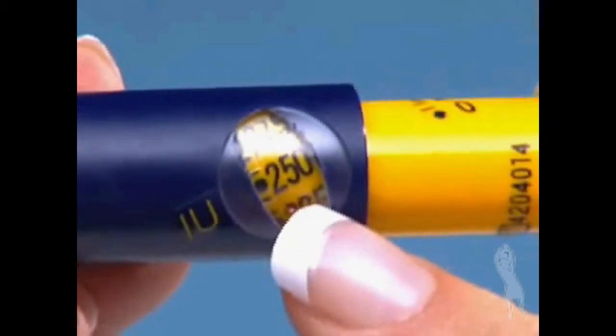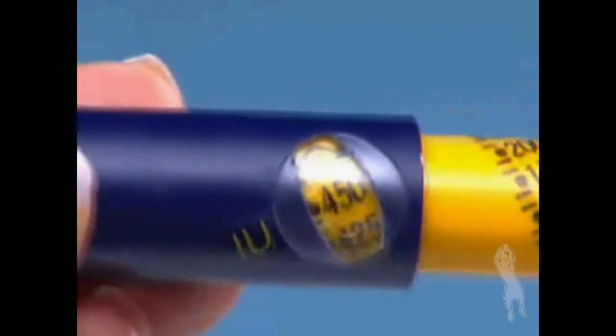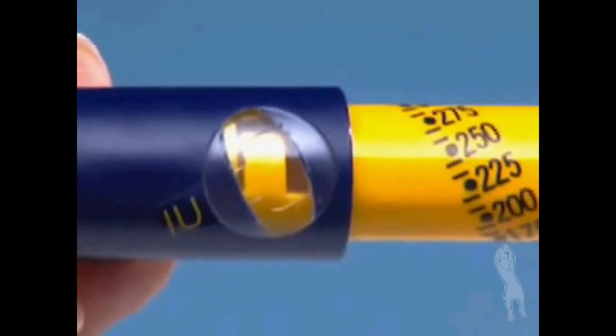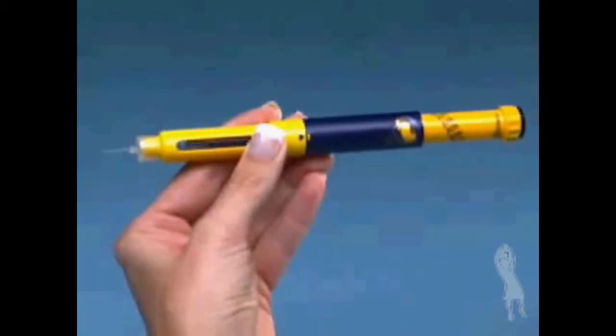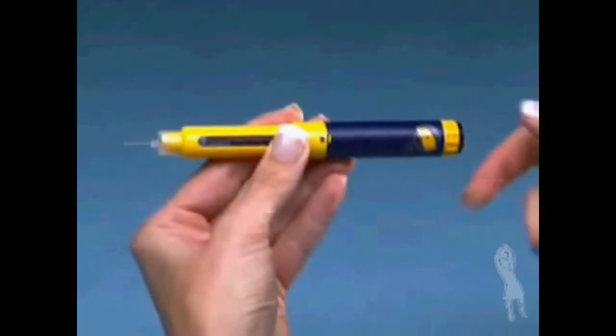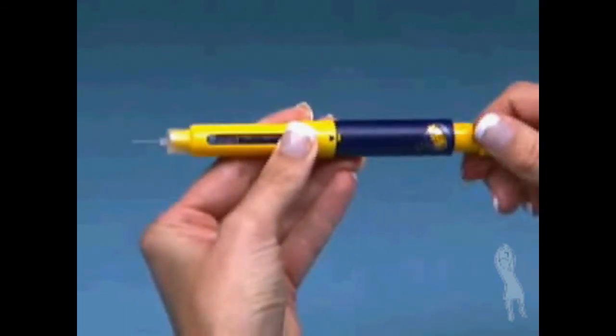If by mistake you dial past the correct number, do not try to turn the dosage knob backward to fix the mistake. Continue to turn the dosage knob in the same direction past the 450 units mark, as far as it will turn. The dosage scale must move freely. Push the injection button in all the way. Dial again starting from 0 upwards.